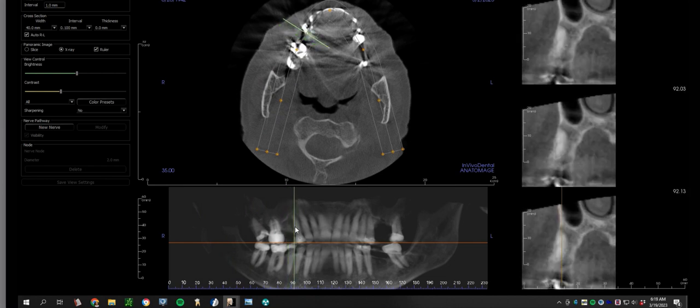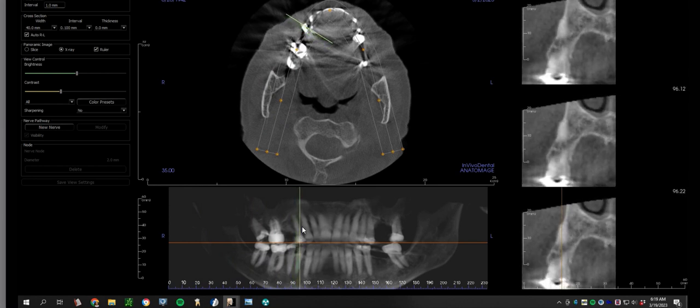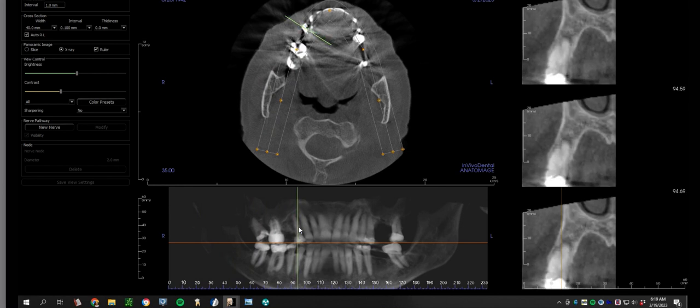All right, so now I'm coming across tooth number 4, and again I'm looking at the apex. Everything looks good there. As you start to look at these more and more, you're going to see things like this. This is not pathologic. This is just an artifact of the slice that we took. And you'll start to develop what we mean by that. There's still some trabeculation in there, so I know that's just an artifact of the slice.